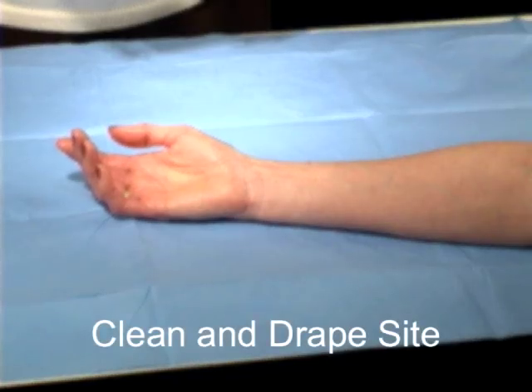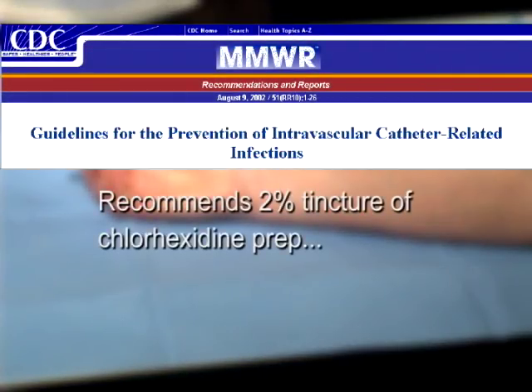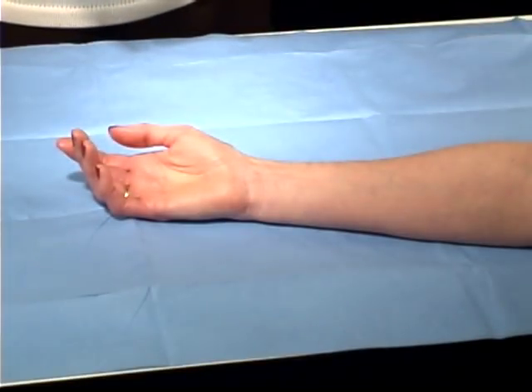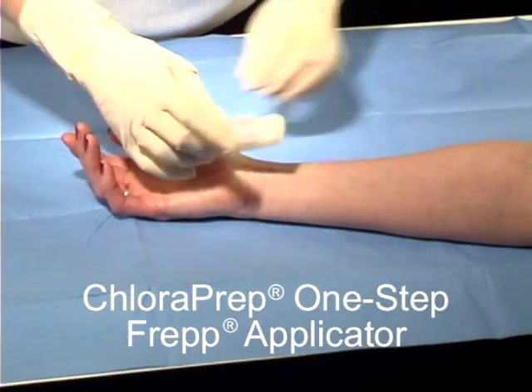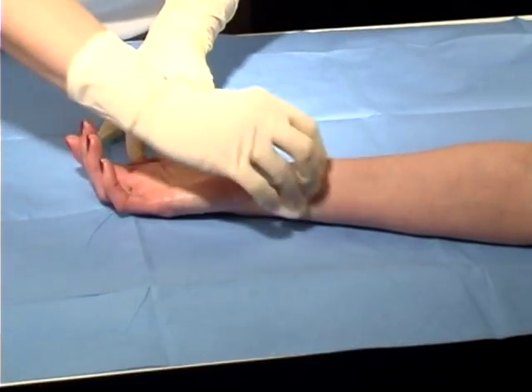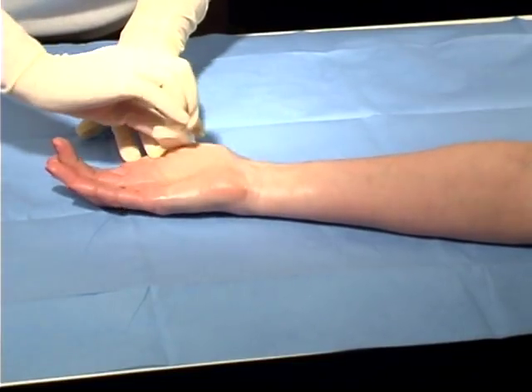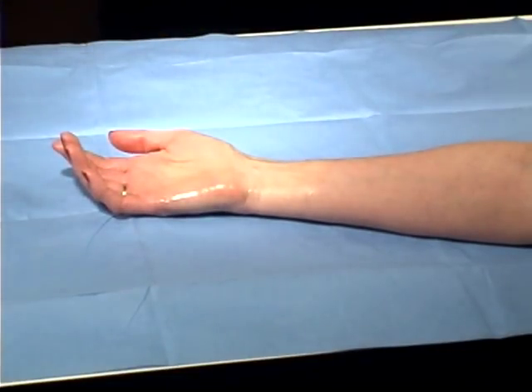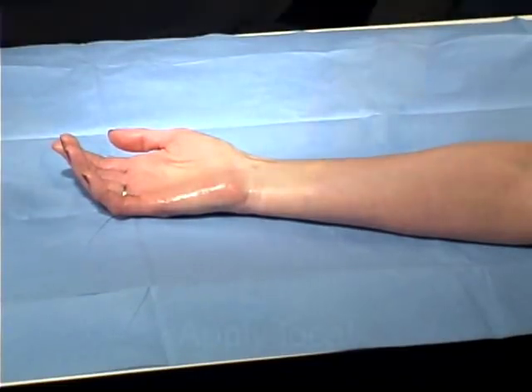Next, prepare and drape the chosen site. The new CDC guidelines for the prevention of intravascular catheter-related infections recommends the use of a 2% chlorhexidine prep. This demonstration shows the use of the Chloroprep one-step prep applicator, which contains chlorhexidine gluconate 2% and isopropyl alcohol 70%. This combination allows for quick disinfection with only 30 seconds of scrubbing and quick drying of the solution — a matter of seconds rather than the several minutes needed for complete drying of povidone iodine.